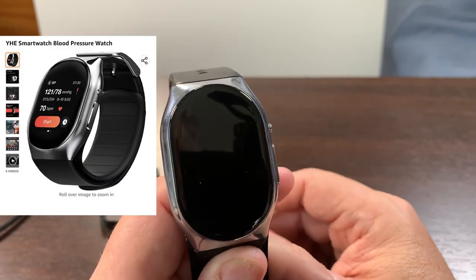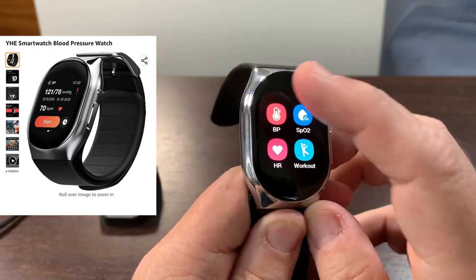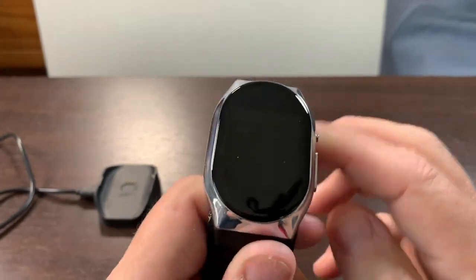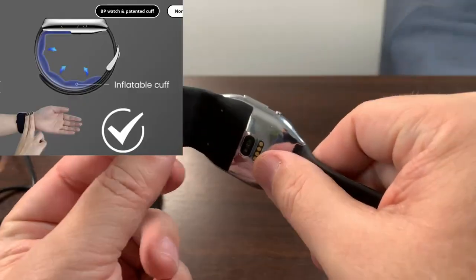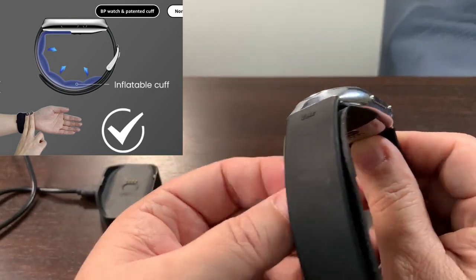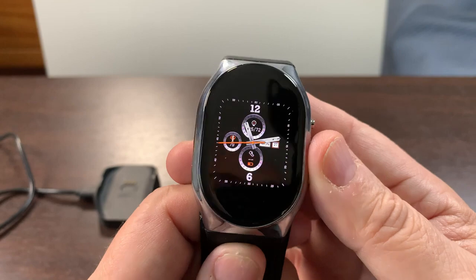Welcome to the Gary Abbott watch review. This is the YHE smartwatch blood pressure watch — it actually has blood pressure monitoring. It'll take your blood pressure, and you've got to see this: it has an inflatable band that inflates with air to help get the blood pressure reading. It also has different watch faces.